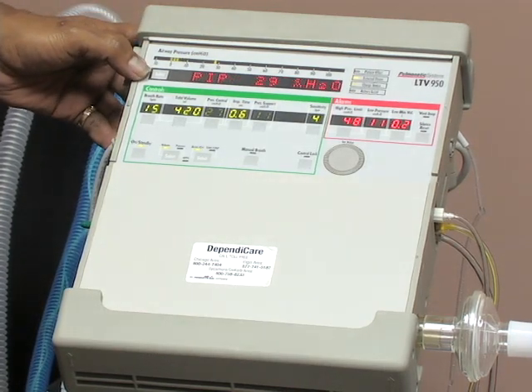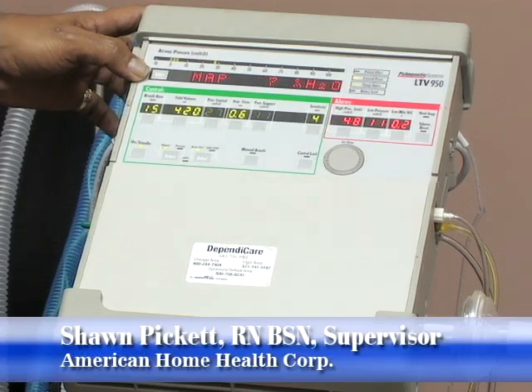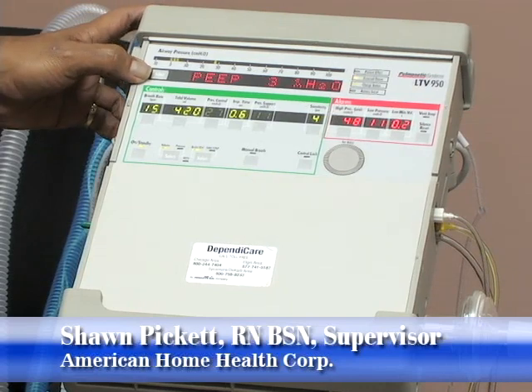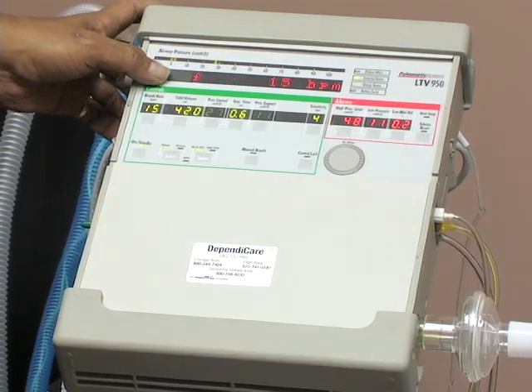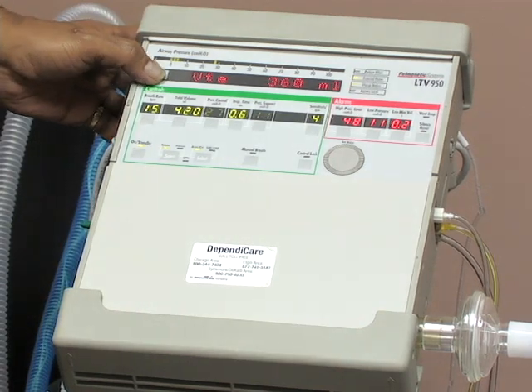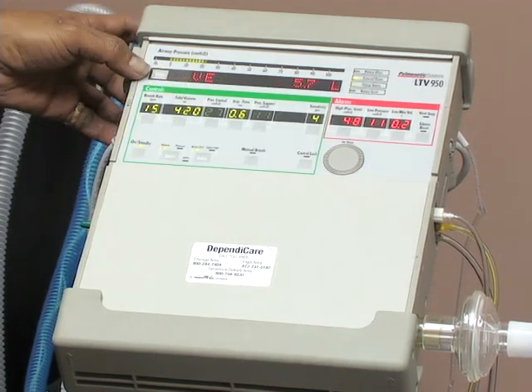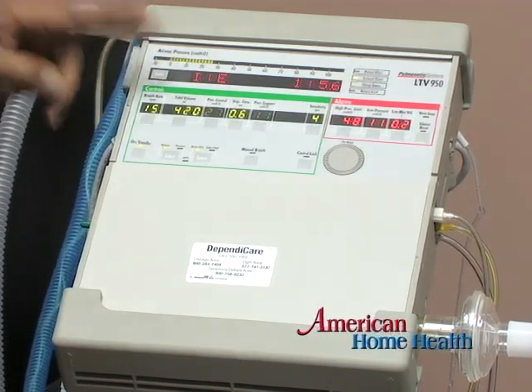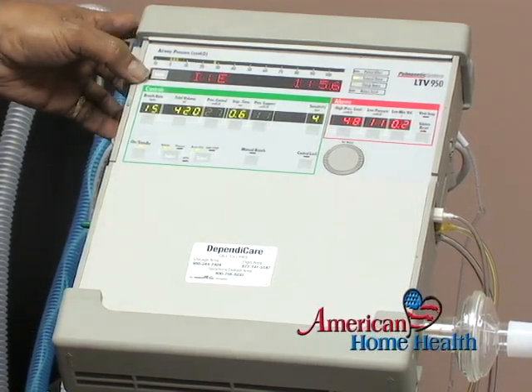Okay, now let's discuss our readings. This is our reading screen where we read our actual measurements that are going on in the circuitry and in our client. It's in scroll mode. To take it out of scroll mode, hit select, and you can look at each one individually and study as you need.